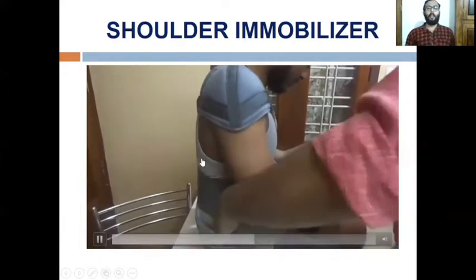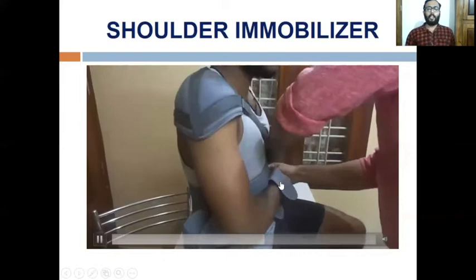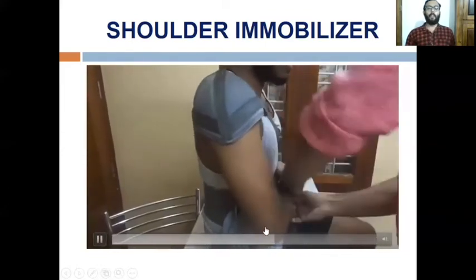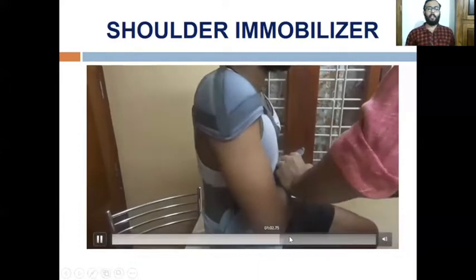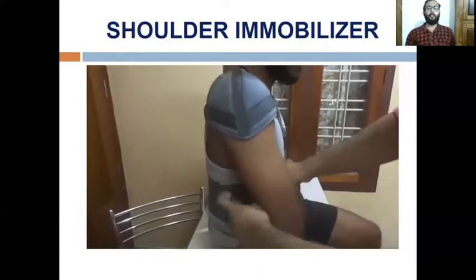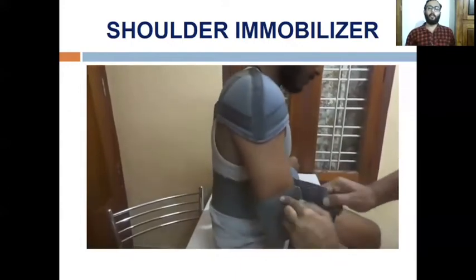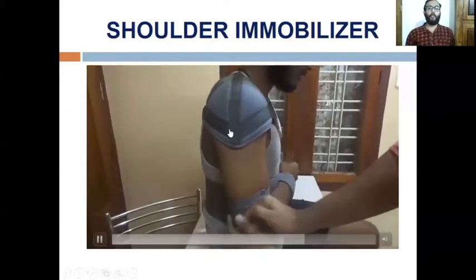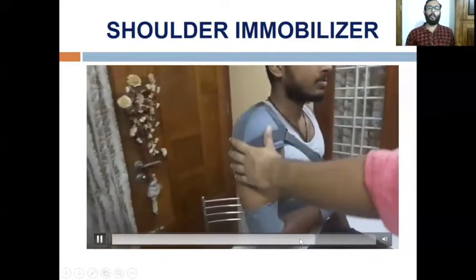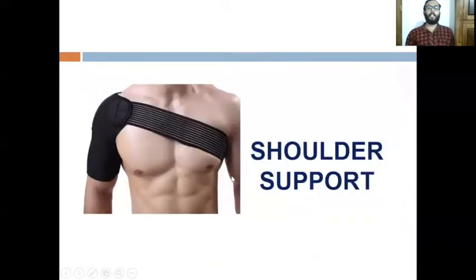One strap is applied at the distal end of the forearm near the wrist and another at the distal end of the arm near the elbow. The shoulder immobilizer should be worn during sitting position, lying position, and also during sleep at night. The patient's elbow should be rested on a pillow.